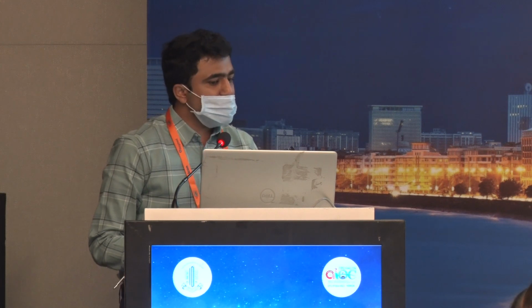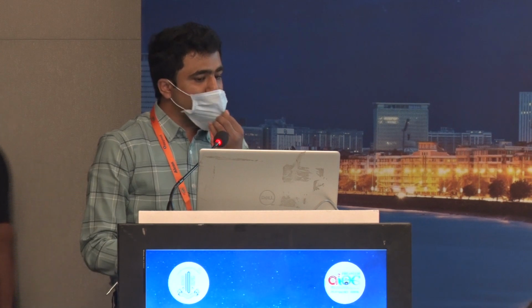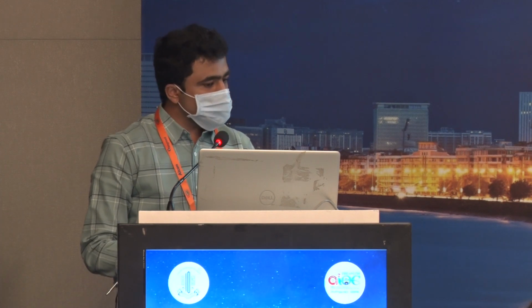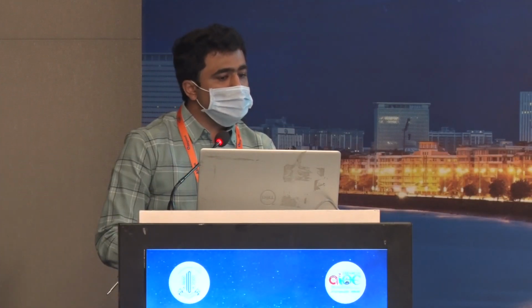Optical rehabilitation in patients with aphakia presents a unique surgical challenge. The choice of IOL implantation in aphakia in the presence of little or no capsular support includes AC-IOL, iris fixated IOL and scleral fixated IOL. Each of these techniques has its own merits and demerits. AC-IOL has the potential for increased damage to the corneal endothelium and angle structures, whereas iris fixated IOL has increased chances of pigment release and inflammation.